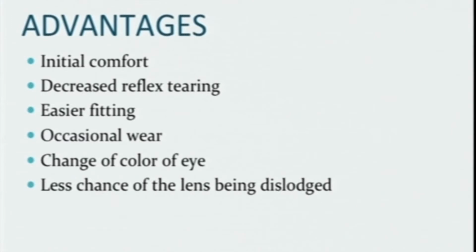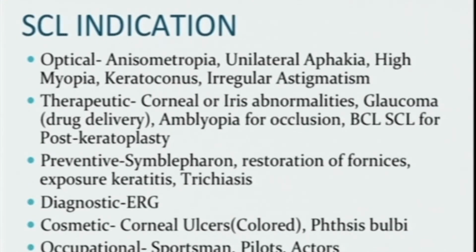You will have to reassure the patient, and fitting will be easier if you sit along with the patient other than the optometrist, if you have time. And you will have to talk about the advantages of occasional wear and change of color of the eye and less chances of lens being dislodged which the patient might be having. The soft contact lens indications are optical, therapeutic, preventive, diagnostic and cosmetic, and some occupational also.